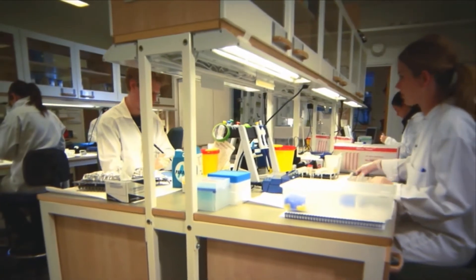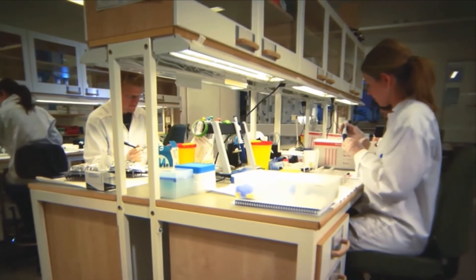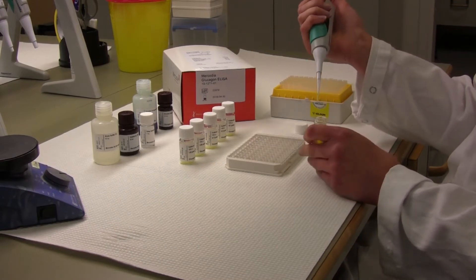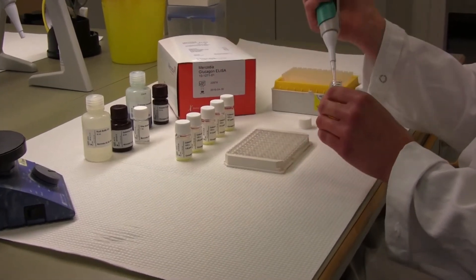This is an instructional film for the use of the Mercodia glucagon ELISA. The Mercodia glucagon ELISA is a simultaneous sandwich ELISA used for the specific determination of glucagon in a sample.